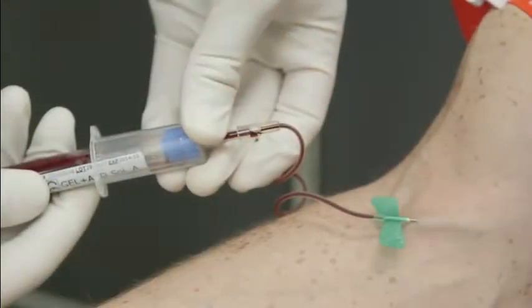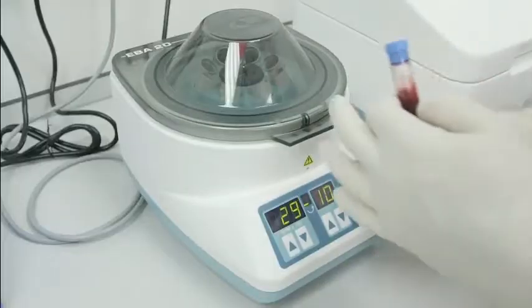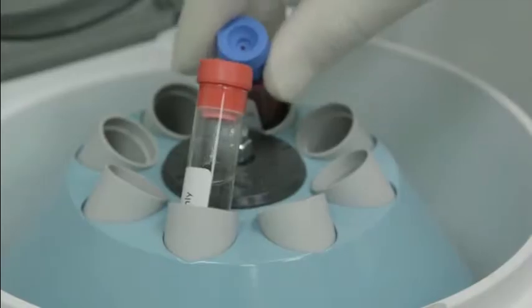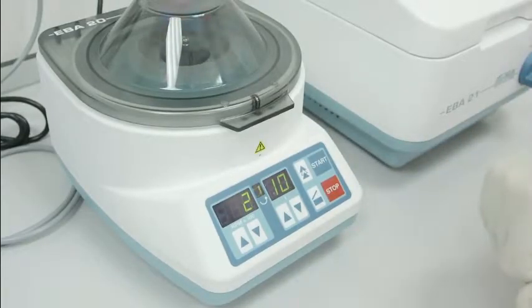Your doctor will then remove 10 milliliters of venous blood, which is stored in a specially designed blood container. This is placed in the centrifuge and spun at 1500 G's for 10 minutes, which allows separation of the various blood products.